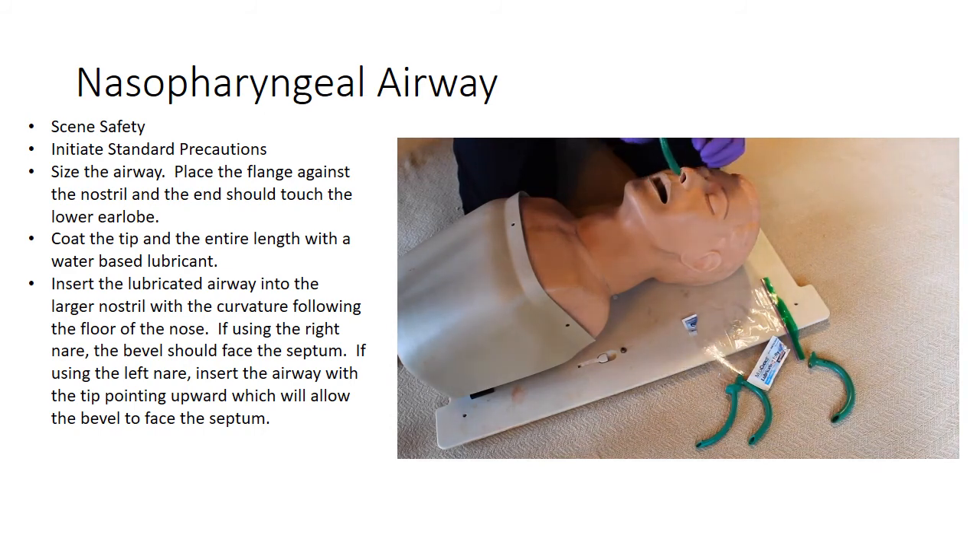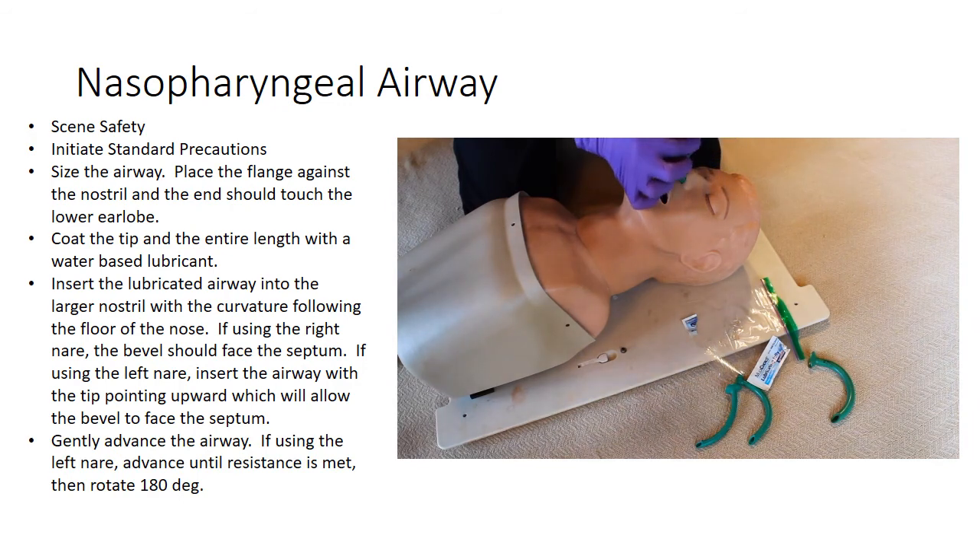Gently advance the airway. If using the left nostril, insert the nasopharyngeal airway until resistance is met and rotate the nasopharyngeal airway 180 degrees into position. This rotation is not required if using the right nostril. Continue until the flange rests against the skin.